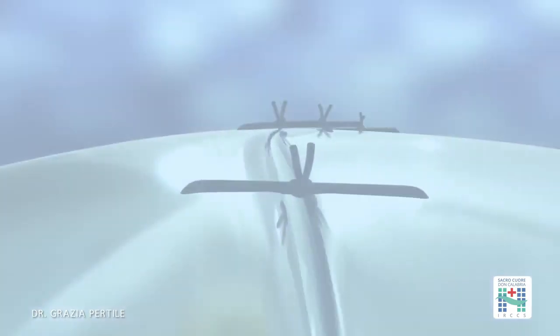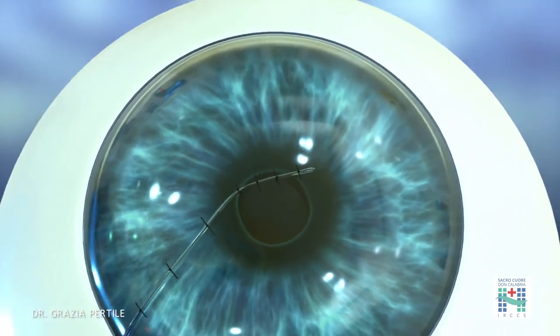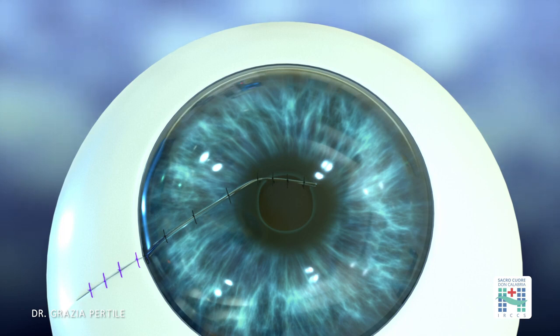At the end, it is crucial to restore the intraocular pressure to be able to comfortably bury the knots. Furthermore, at this point, it may be necessary to replace some sutures to fine-tune their tension.